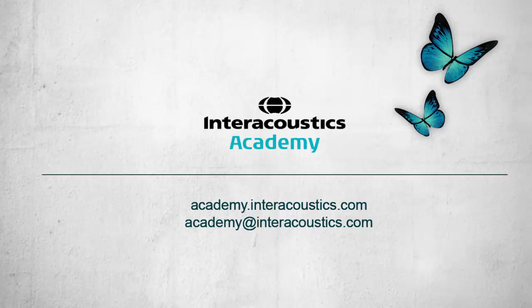Jasmine asks, can you explain again what an inhibitory response is? An inhibition of a muscle response means that the muscle is going to relax. If you think of the head rested, just looking forward, the muscles aren't contracted, they're just relaxed. So when you record a cVEMP, you're not going to be able to make them relax much more than the state they're already in. So what we're going to do is contract the muscle by turning their head to the opposite side of the ear being recorded. That's going to tense the muscle, so that when we generate the cVEMP stimulus, it's going to allow the muscle to relax, or in other words, inhibit. So hopefully that's made a little more sense for you, Jasmine.